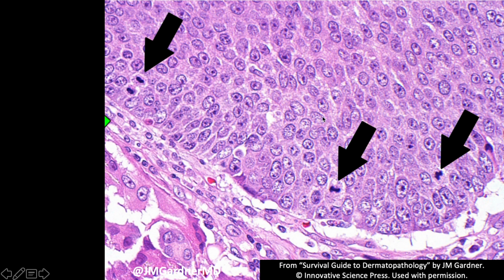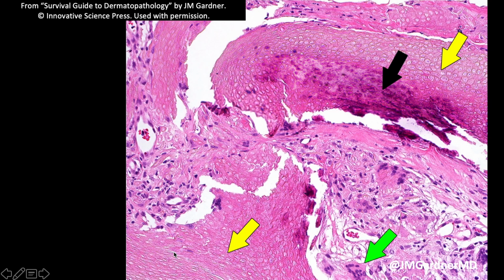So you could get concerned about basal cell. If the cells were closer together, you could even think a little about Merkel. I've seen this tumor mimic Merkel cell before when there was only a small piece present. But look down here, we got some giant cells. And look over here in a different part of the specimen, we see these sheets of pink ghost or shadow cells that basically are sheets of dead keratinocytes that have left behind the outline of the cell borders and of the nuclei that have all dissolved and gone away.